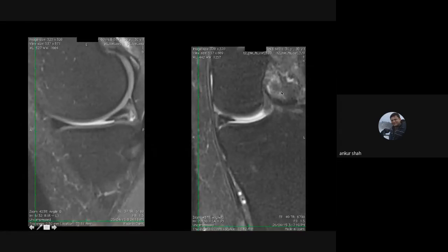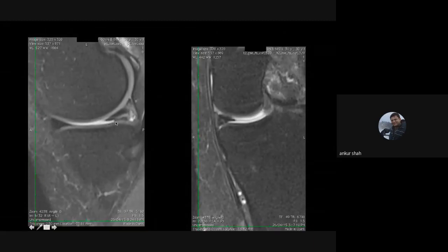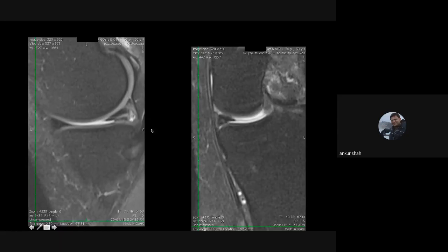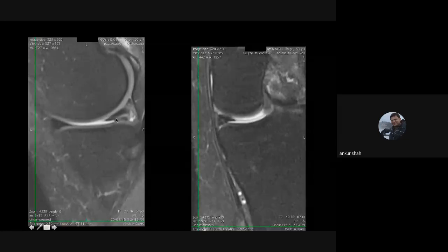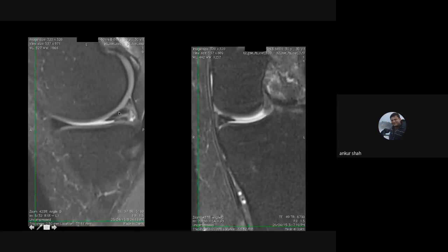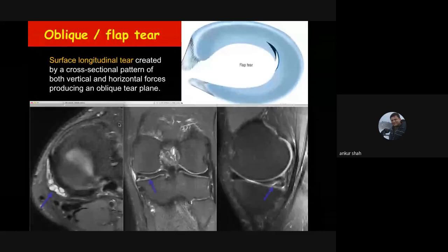Because it is a soft loose body, it will not be seen on radiograph. Many patients with a flap tear present with a locked knee and no loose body visible on X-ray, but the locking is because of the loose fragment from the meniscus. This can result in blunting of the meniscus — appearing smaller. So when you see a posterior horn that is smaller or almost equal to the anterior horn, always suspect a flap tear with the small meniscal fragment displaced from its normal site.